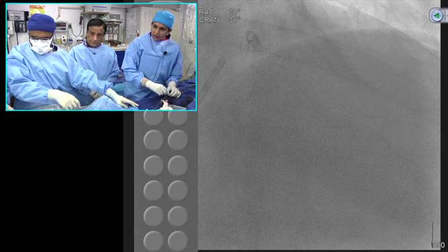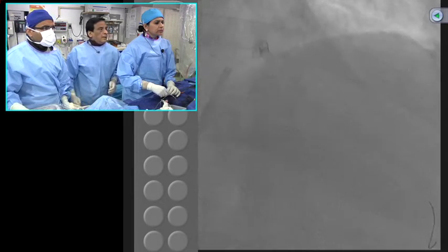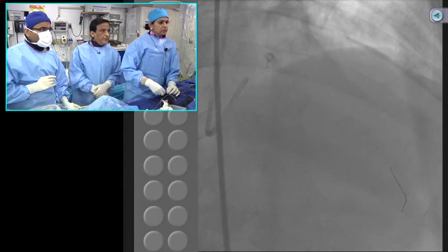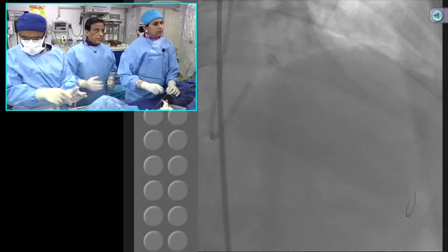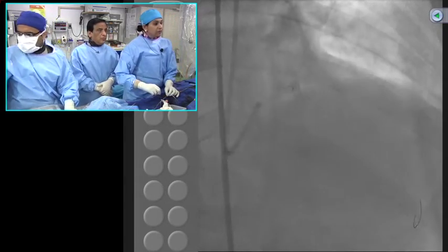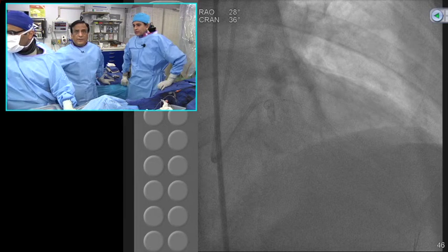Samin, in the meantime, let me get a few questions from the audience. The first one is by Dr. Ajay. He's asking specifically, how frequently do you do iFR and what is its future? It's a very important question. The reason is that iFR had not made it into the guidelines, so we are not doing it because there is still a gray zone, and in those cases you still have to do FFR. We learned that in cases where there is a contraindication, like a patient with aortic stenosis, you might need to do iFR, but we had taken iFR out of our lab, but there is definitely some role in a selected number of cases, yes.